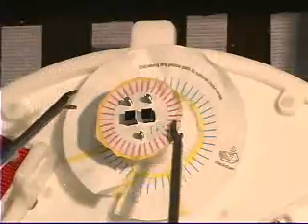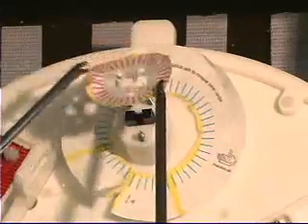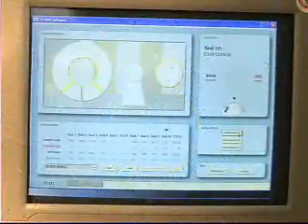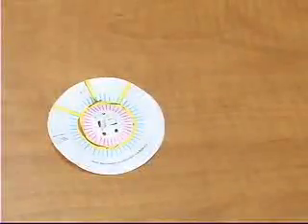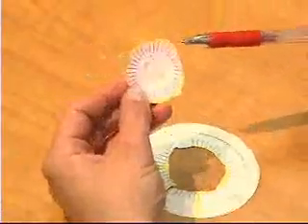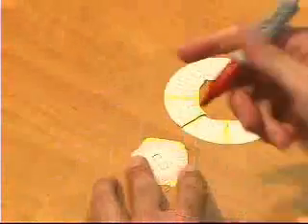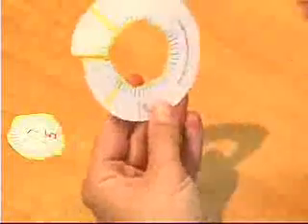Once the circle is cut, it is grasped with 2 forceps and lifted gently from the pod. Once it is removed from the pod, the task will be sensed as completed. Scoring of the circle task is done by counting all of the areas of blue around the inner circle and all the areas of pink in the outer ring. Each color mark is assigned 5 points, up to a total of 100 points. The cutoff time for this task is 300 seconds.